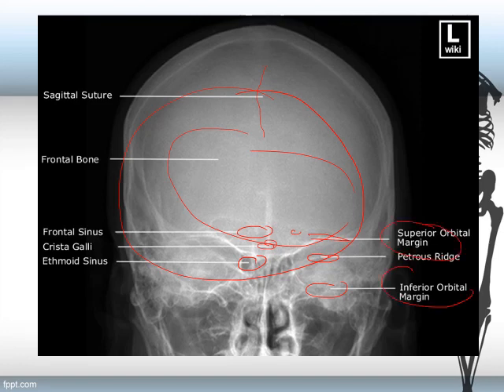So, not necessarily the actual parts of the body or the skull in the radiograph. Hopefully, at the end of our semester, you will be able to identify some parts. Kahit some parts lang. I am not expecting you to identify all these parts in the radiograph, okay? So this is just the introduction.